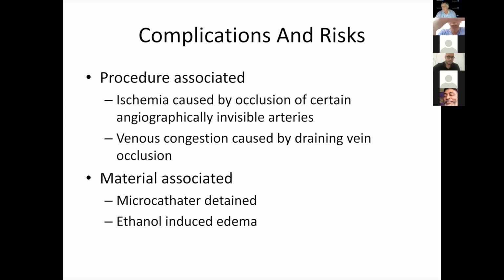You can identify the location by the superselective angiography through microcatheter, or you can identify the exact location of the draining vein where you can sacrifice the venous collector through the later venous phase of angiogram.